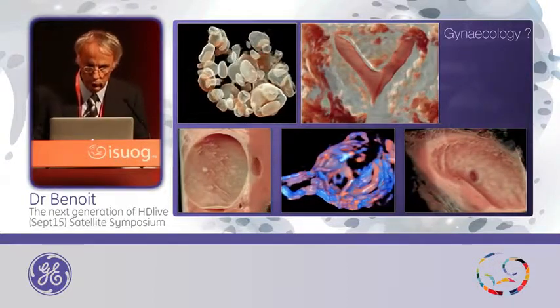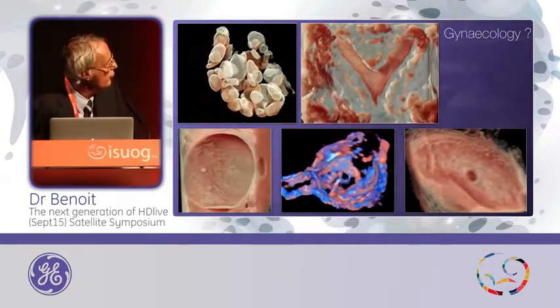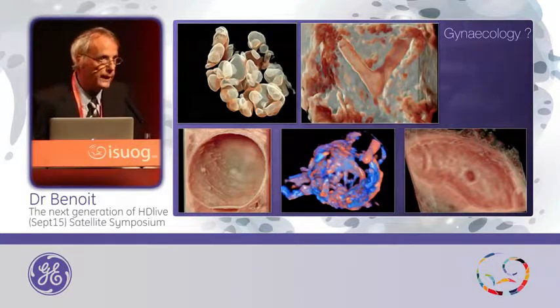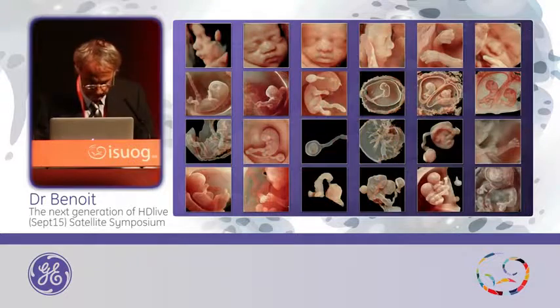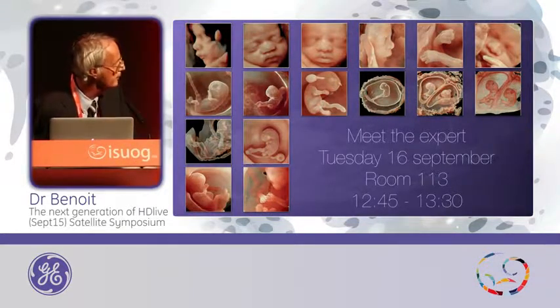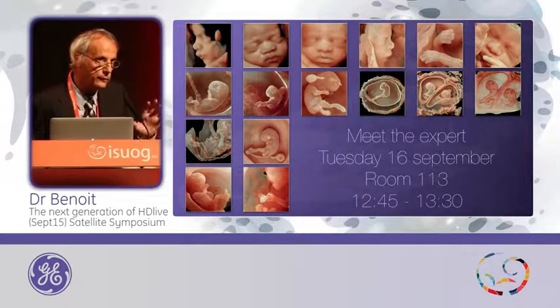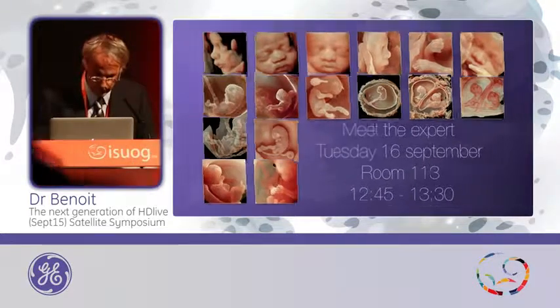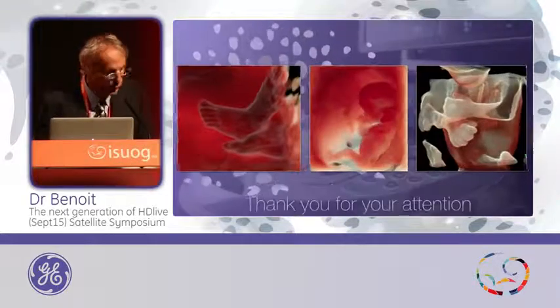So you saw what is possible to do with this new rendering mode, and it's really exciting. And if you need, you can come. Tomorrow I have a Meet the Expert session, and in this session, I will show you what we can do with the system, and especially what we can do with this new HD Live. And thank you for your attention.